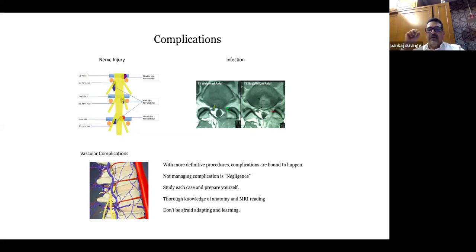try to put your dilator inside, stay there for some time, two to three minutes, and then remove it. Usually that is sufficient. If it is arterial bleeding, it will stop. You may have a big clot over there, you can remove it. But if it still continues, you should not keep on trying. Although it is again very, very rare to have an uncontrolled artery bleed in spine endoscopy. It's very, very rare.